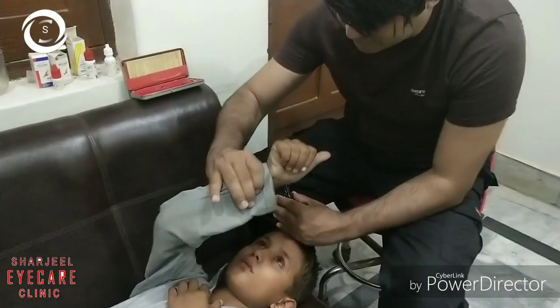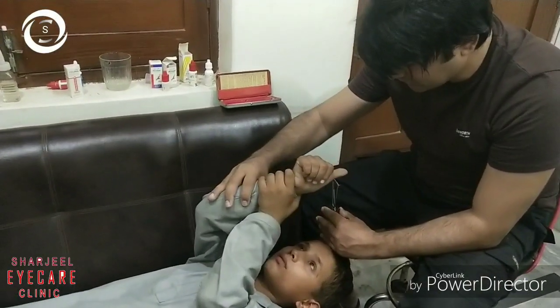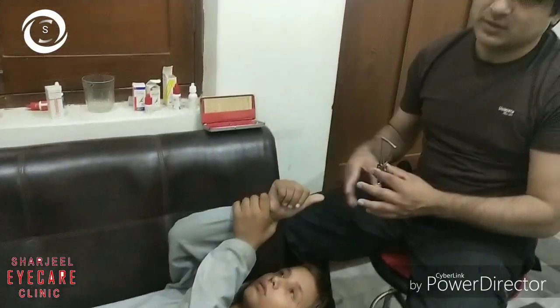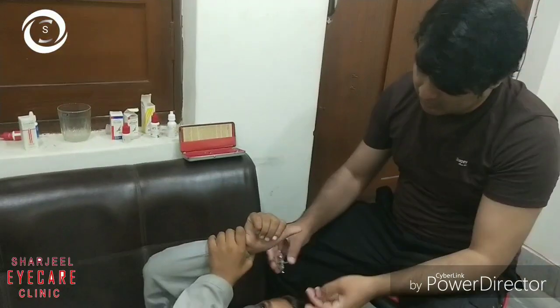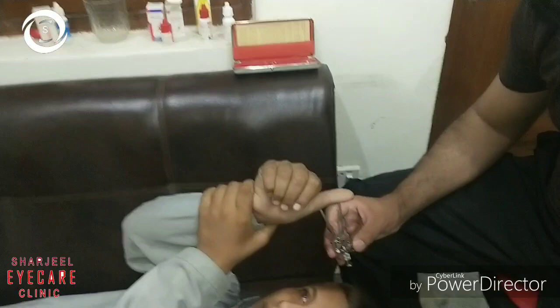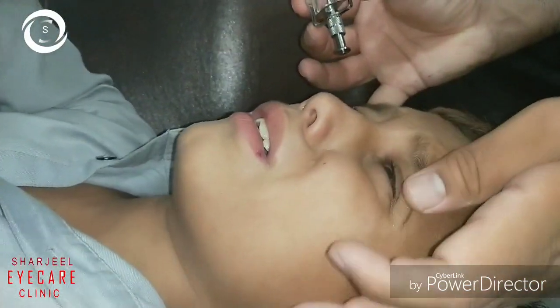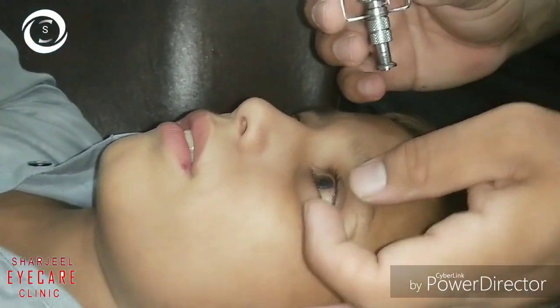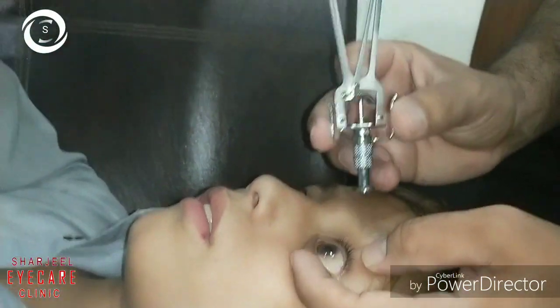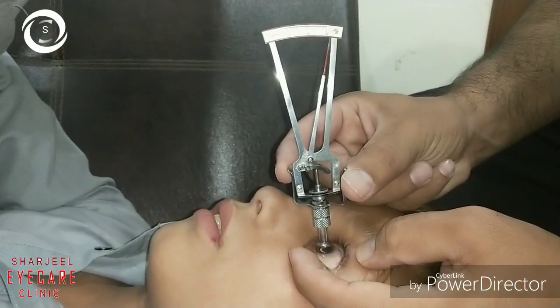The patient should gaze straight ahead towards their right hand thumb. Now gently press the foot plate on the cornea, gently opening the lids and telling the patient to calm down.